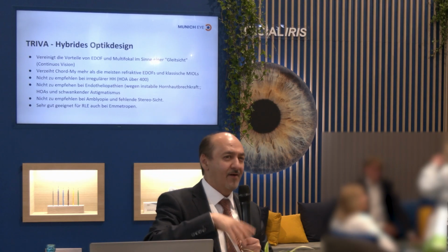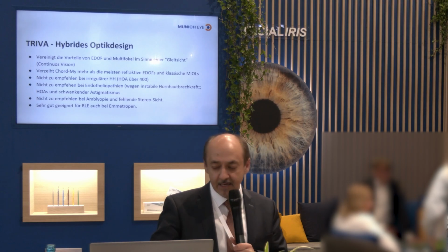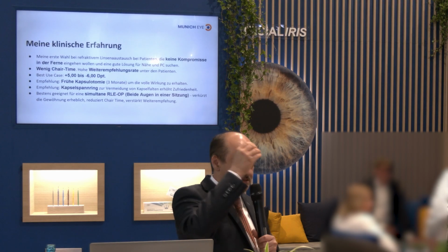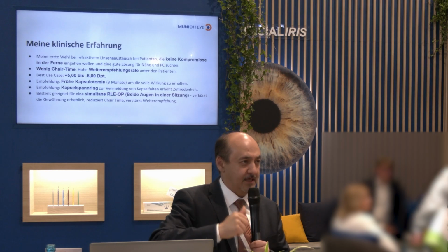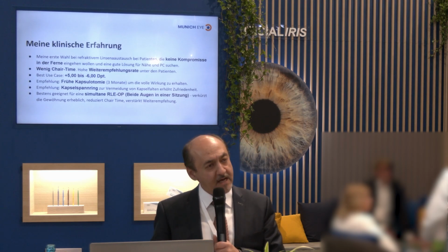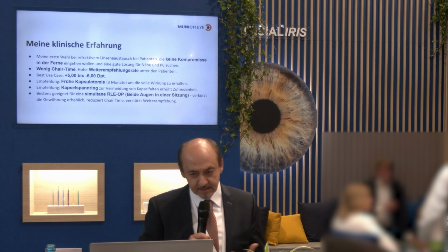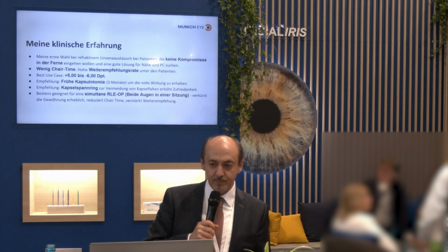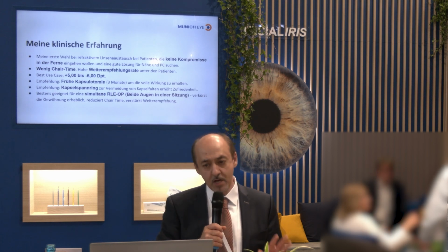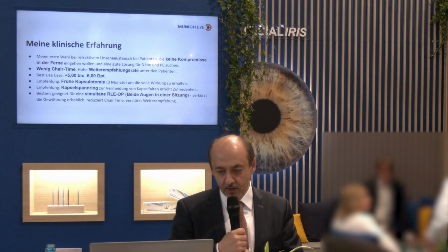Very well suited, even with emmetropes, where they always say, if he didn't have glasses before, you don't do a multifocal lens. If he didn't have distance glasses, you can forget about that here, because it's monofocal in the middle. He doesn't make any issues for you. That is, if he only comes for presbyopia or she only comes for presbyopia, they can do it too. I've done many. They are very satisfied patients. The first choice for me, at least for refractive lens replacement in patients who do not want to compromise at a distance and want a good solution for proximity and PC, you can make these patients very happy with it.